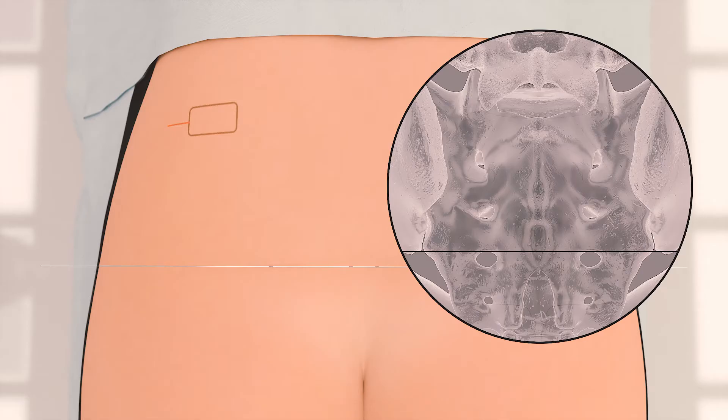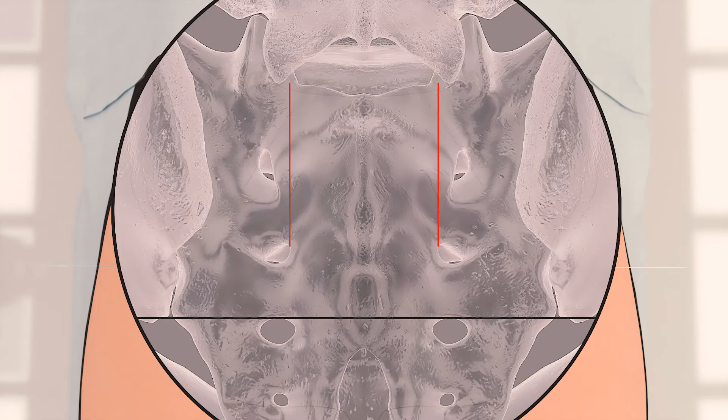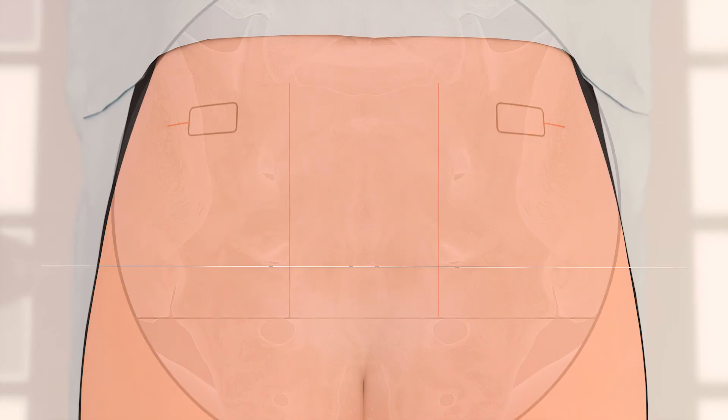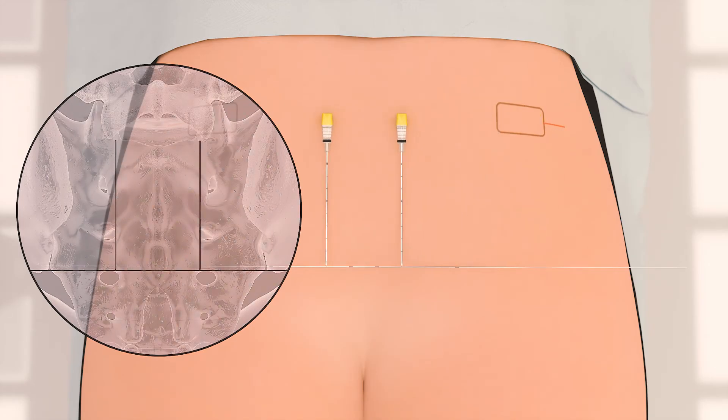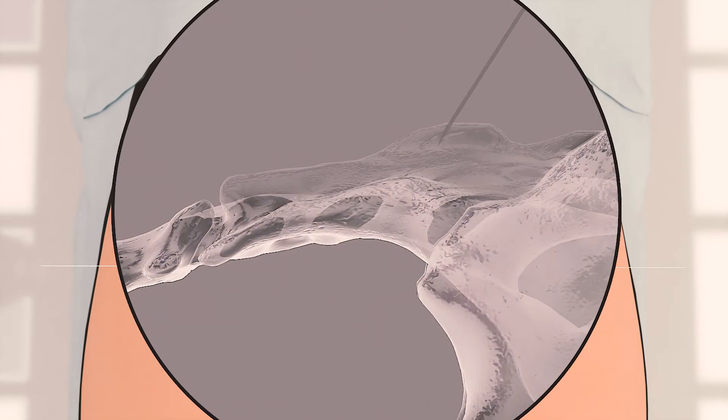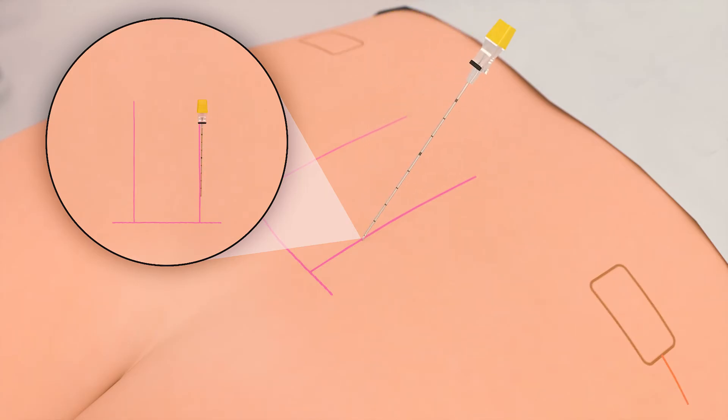The medial border of the foramen is marked bilaterally and used as a landmark to ensure placement of the foramen needle along the most medial aspect. The foramen needles are placed on the skin to assist with marking the medial borders of the sacral foramen. The needle entry point should be determined so that the needle will enter the S3 foramen parallel to and approximately one centimeter cephalad of the fusion plate. Slight adjustments in the angle of the foramen needle may be required to access the foramen. While adjusting the needle angle, the needle should be kept parallel to the midline.